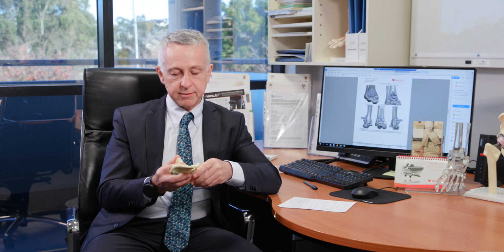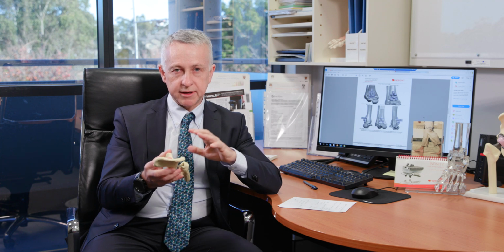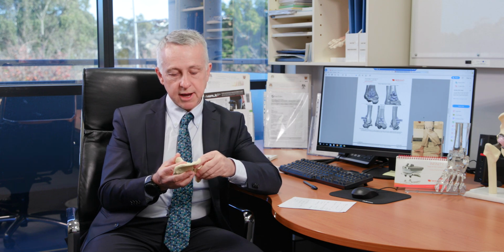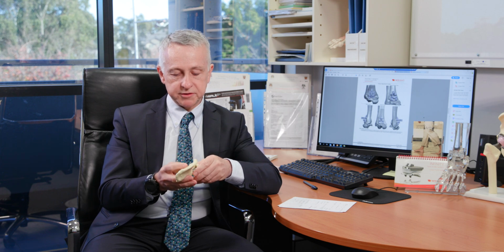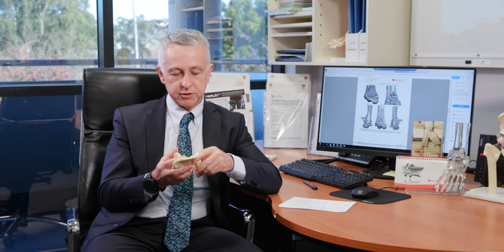The other problem can be leg lengths. It's very easy to lengthen somebody's leg putting in a hip replacement. And if you start getting a discrepancy up around a centimetre, people can become aware of that. It can cause long-term problems. So the navigation increases our accuracy and reduces the risk of a leg length problem. The other problem that can occur is dislocation, where the hip can pop out. So that's where component orientation and soft tissue balancing reduces the risk of dislocation.